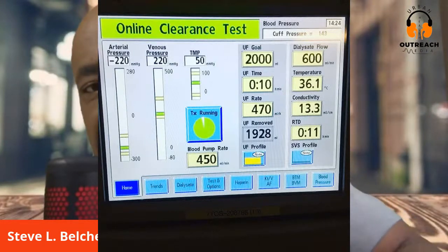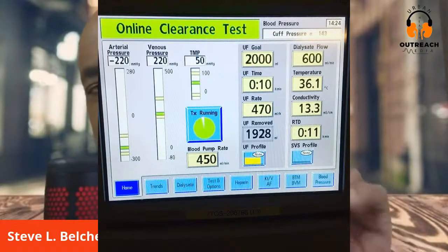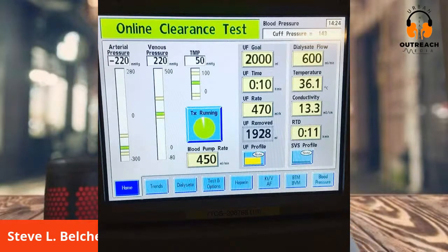Well, this machine has a clock, and that machine is going by that clock. So I bring this up because some warriors, when they go on dialysis, look at the clock, which may be a different time, maybe off by 3, 4, 5 minutes. It may be different from the clock in the machine where it says 1424. And so a person says, oh, I'm supposed to calculate your time.